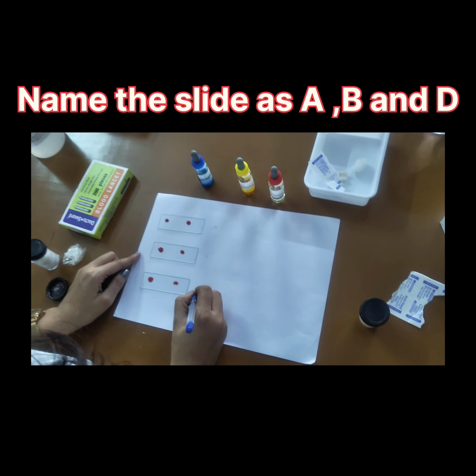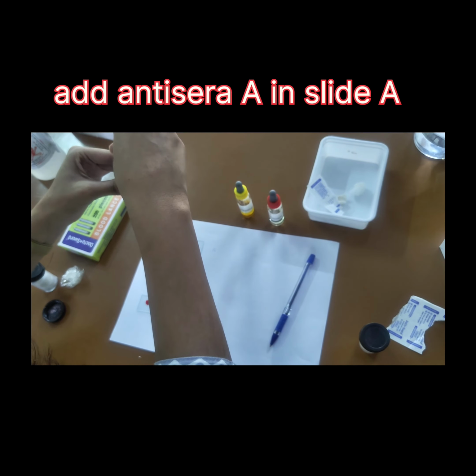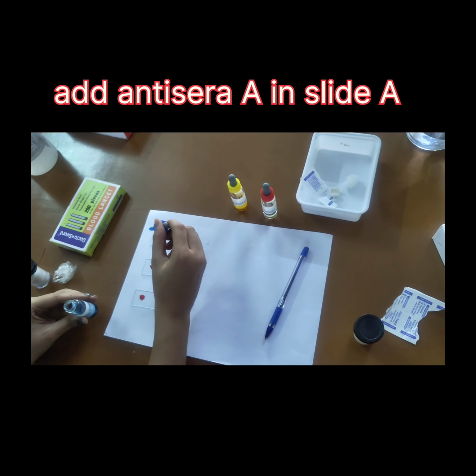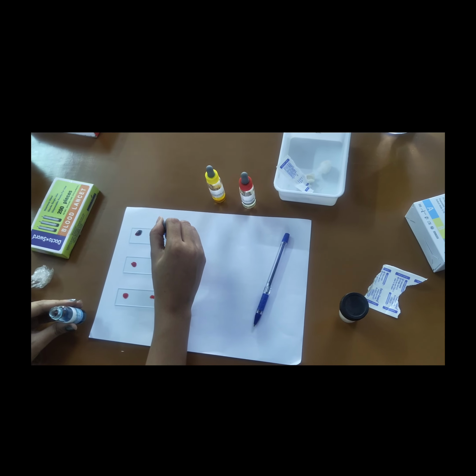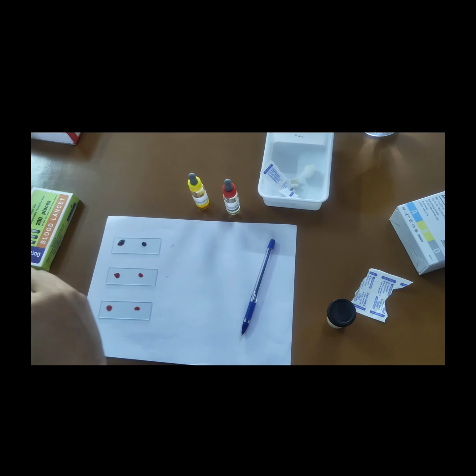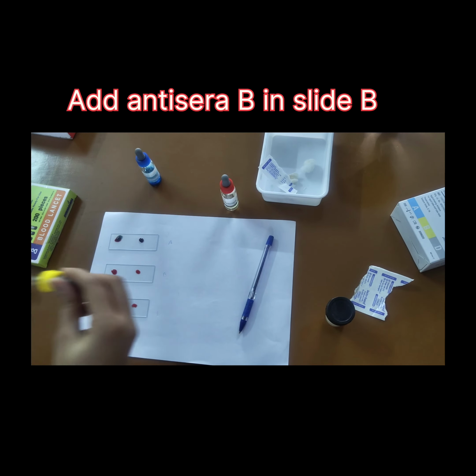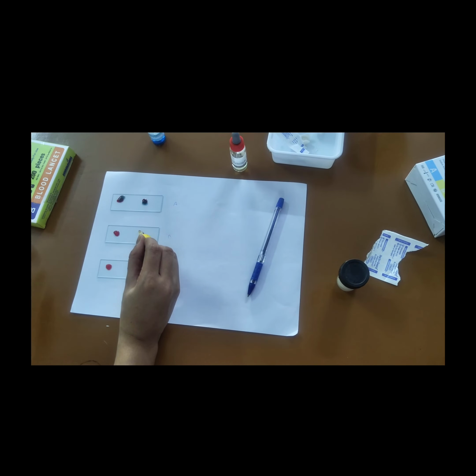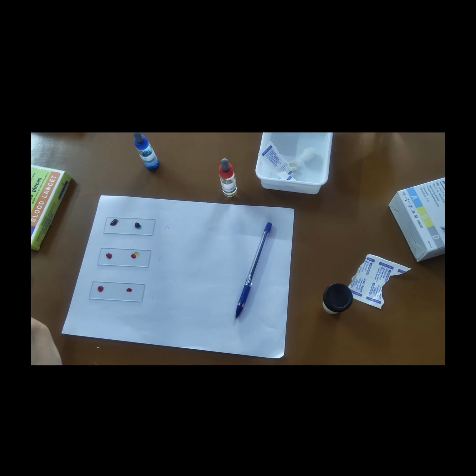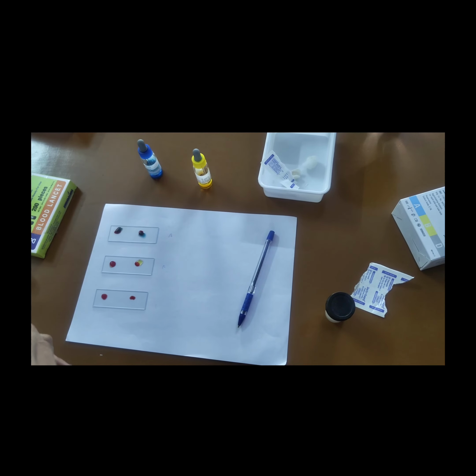Now name the slide as A, B and D. After that, add antisera A in slide A, antisera B in slide B, and antisera D in slide D.